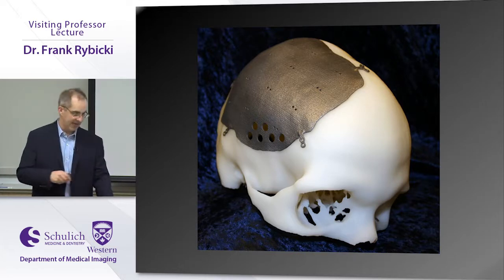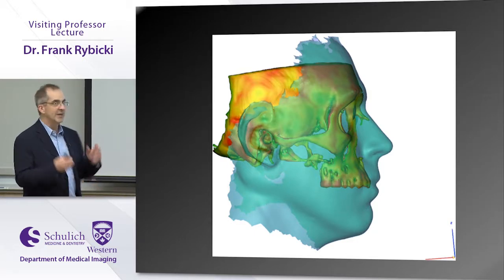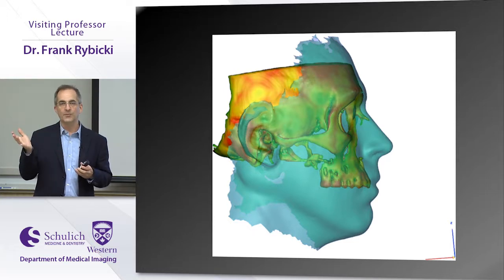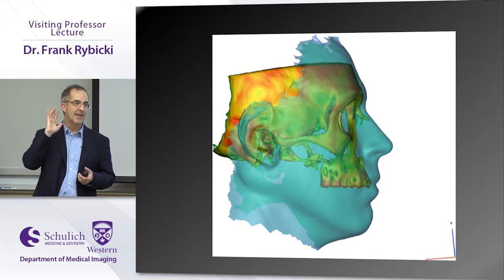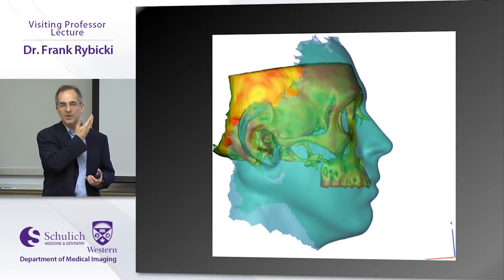These are all 3D printed now. It's virtually malpractice to do it any other way. You can actually do a patient that's had a gunshot wound or an MVA. You can go to old photographs, or you can do a digital photograph of the other side, and contour out what the reconstruction would look like from the normal side, the one that's not injured, or the one without the tumor.